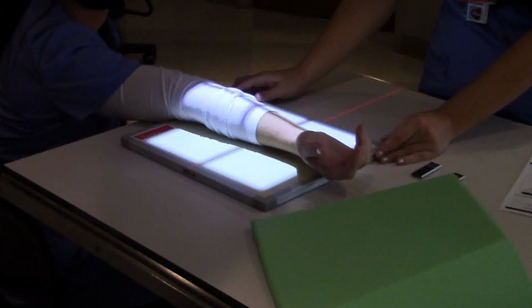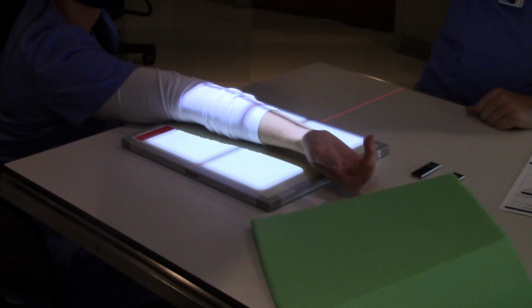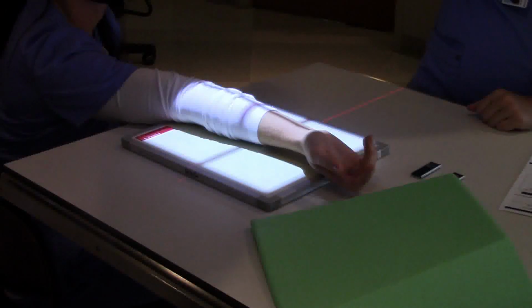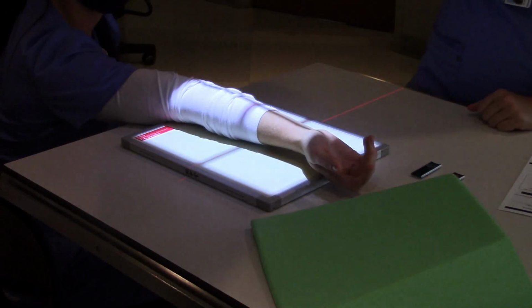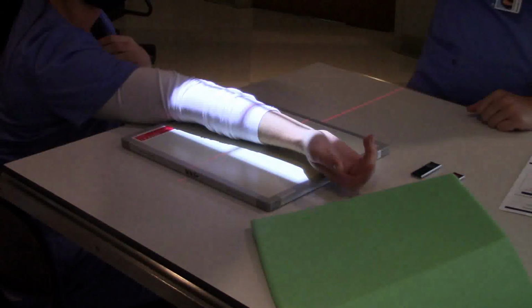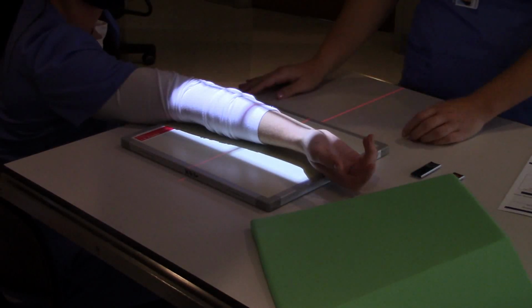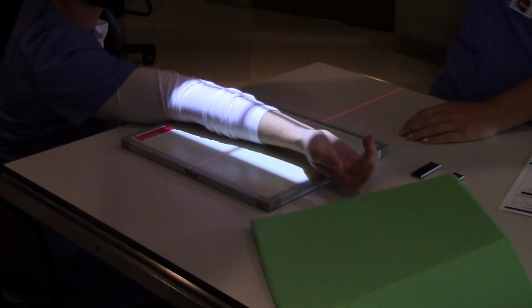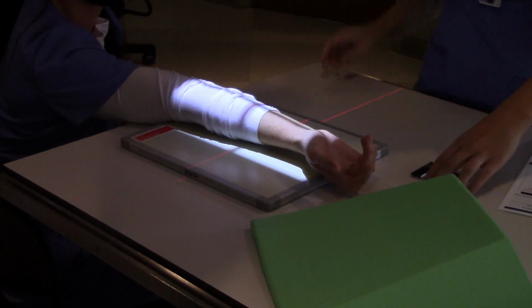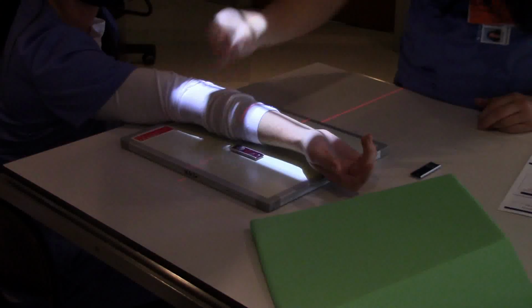Okay, very good. Okay, what's the examination we're doing here? An AP forearm. All right, cool. Very good.